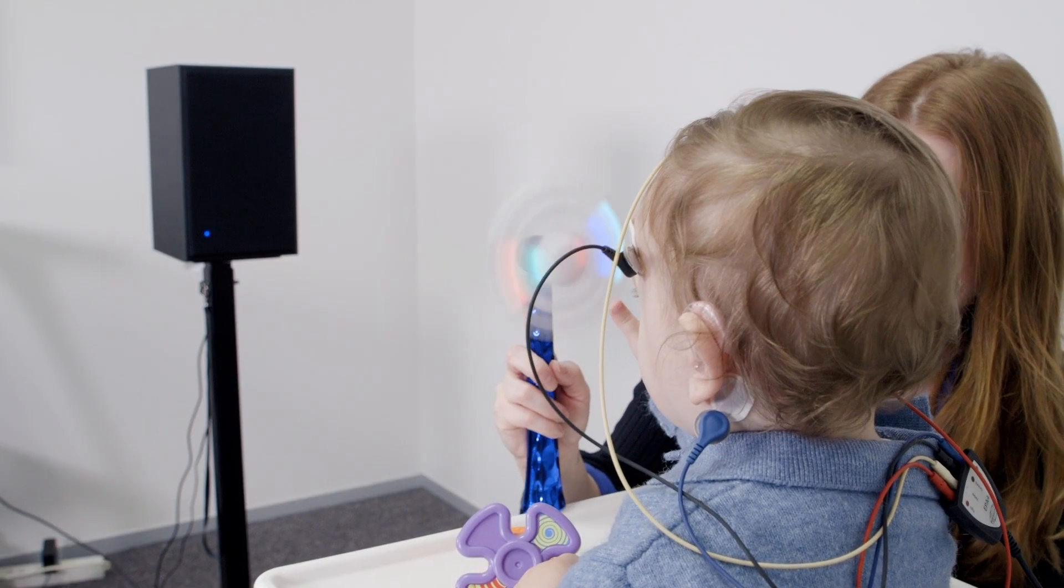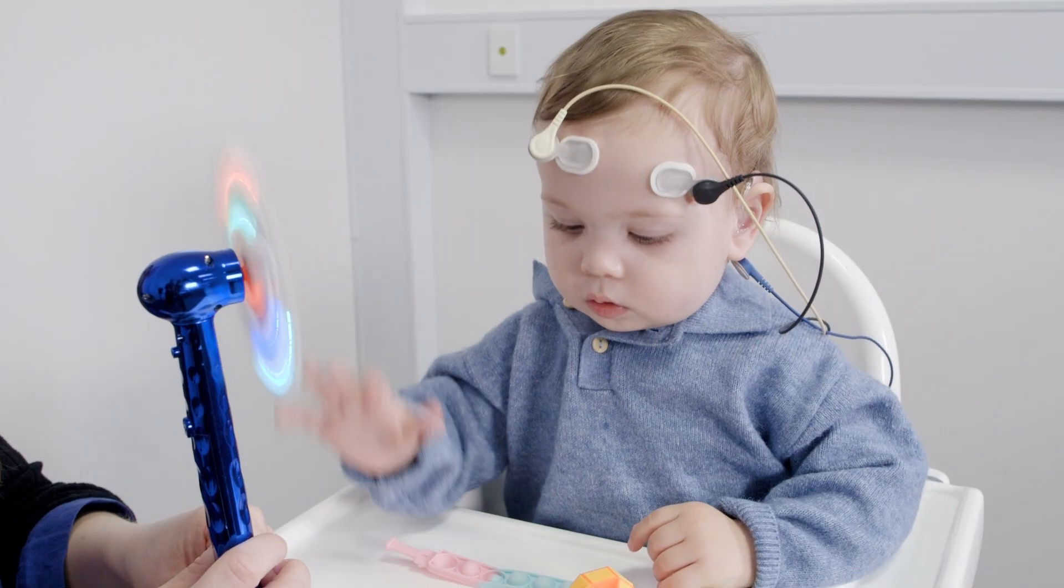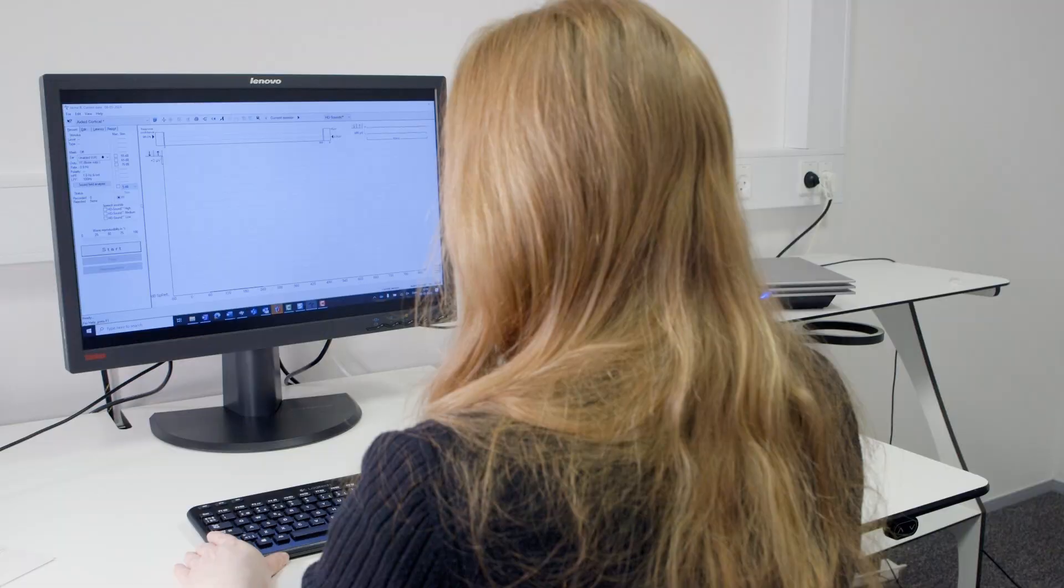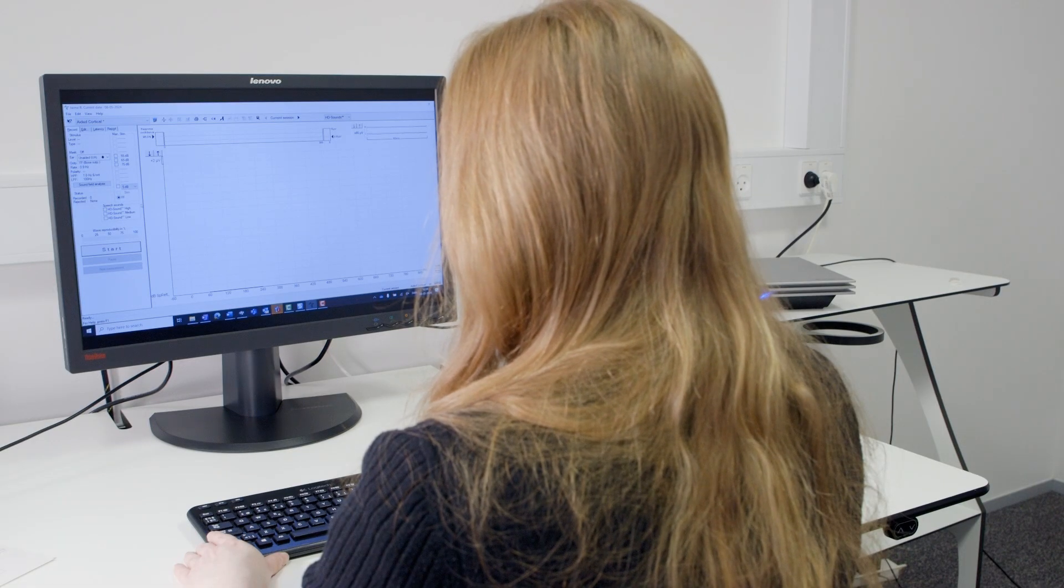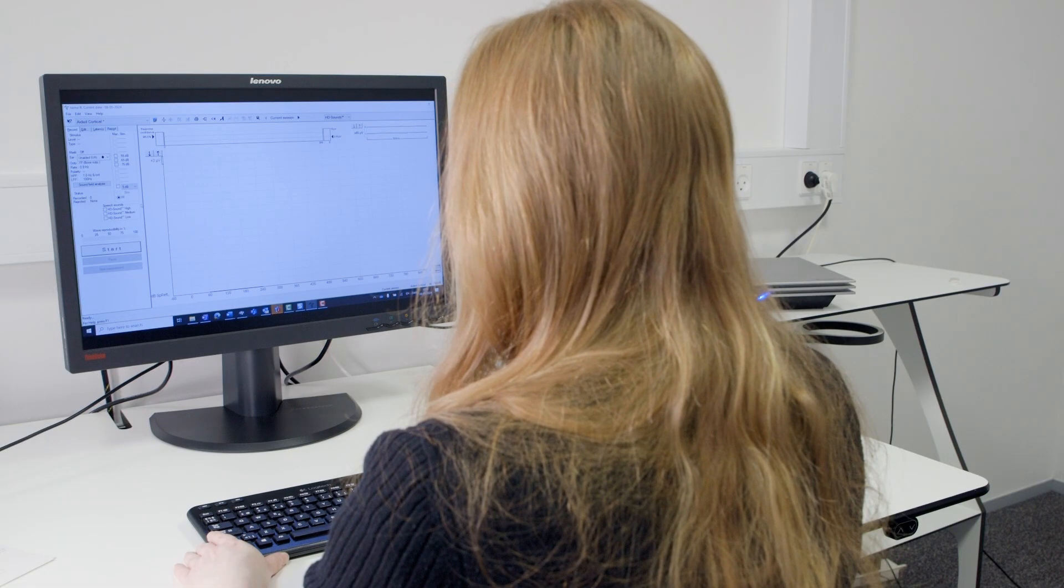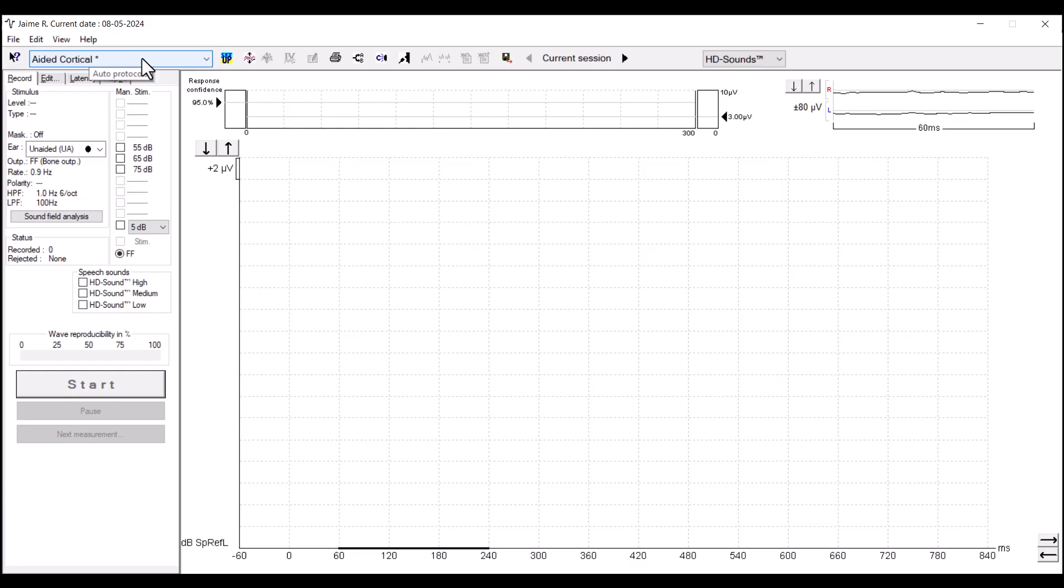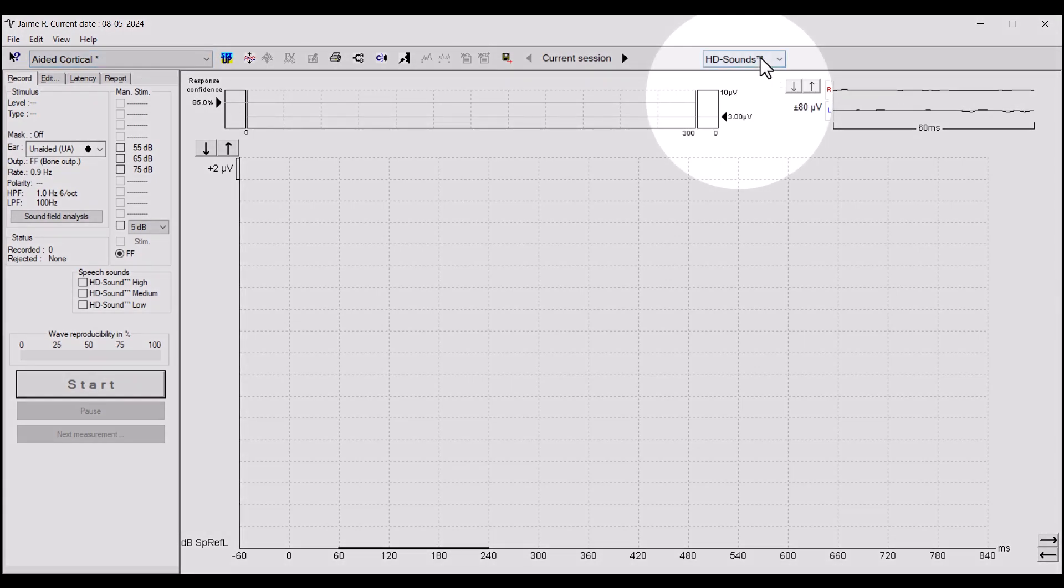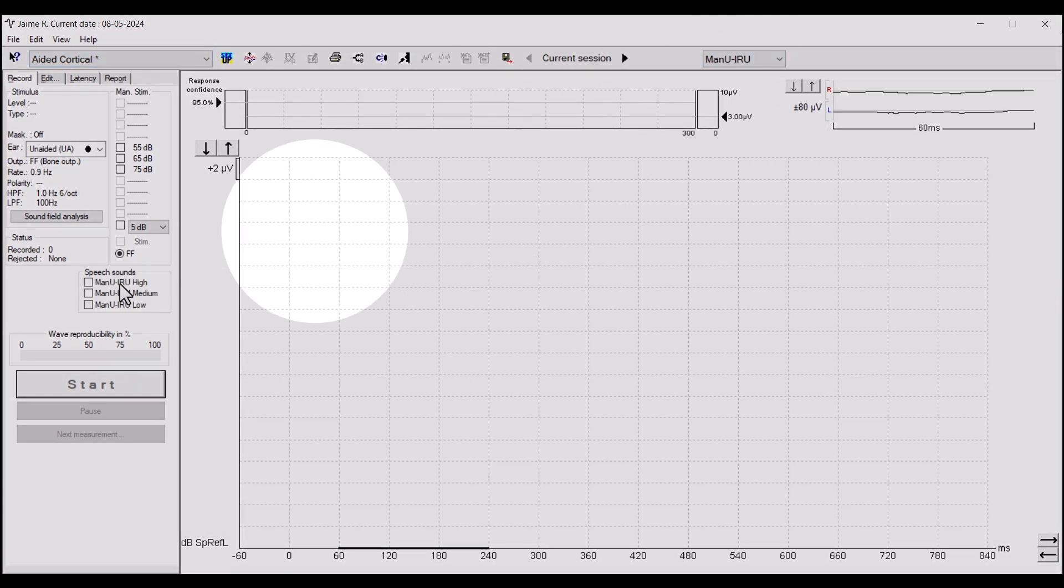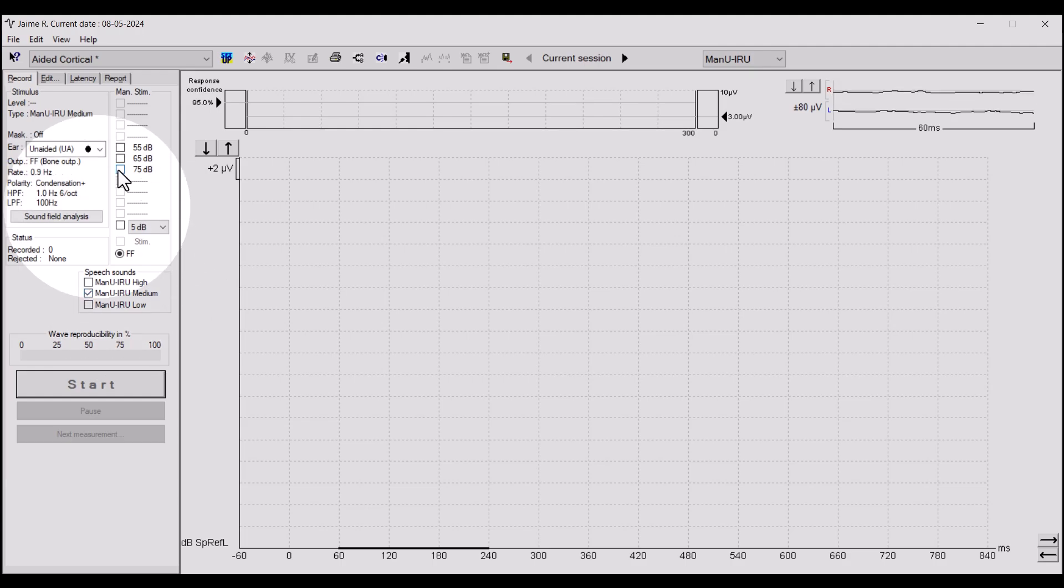The software includes three default aided cortical protocols. You can use these for testing both the aided and unaided condition. Select the stimulus group, stimulus type, and intensity level that you're going to test.